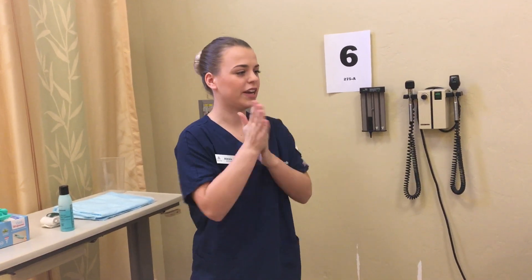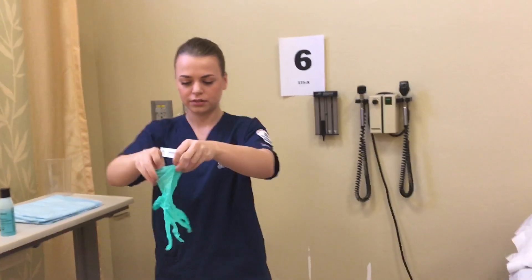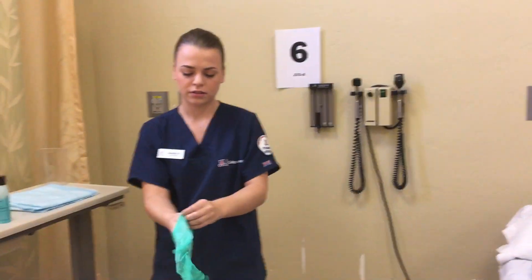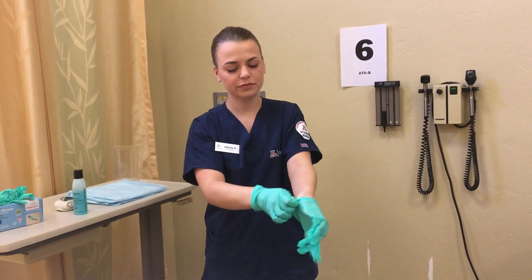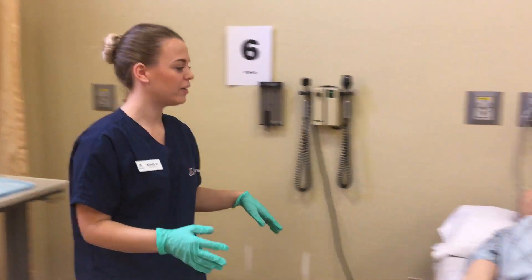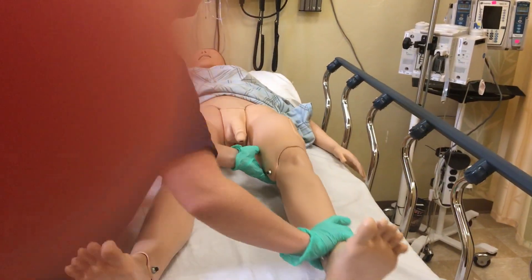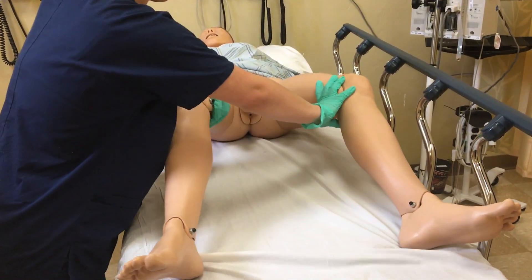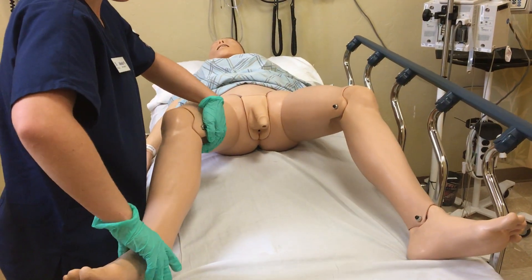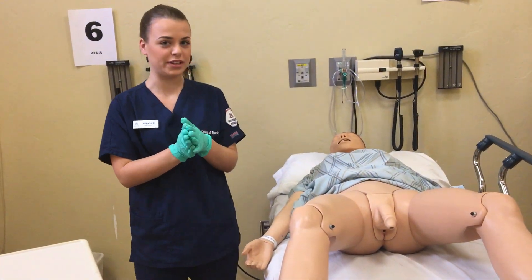I've raised the patient bed to working height, but I have the one side rail up opposite me, and then I'm standing over here so the patient is in a safe position. I'm just going to start by lifting your gown and getting your legs in a comfortable position, so you will be exposed. At this time I would offer the patient pericare, but for testing purposes I'm going to skip this step.